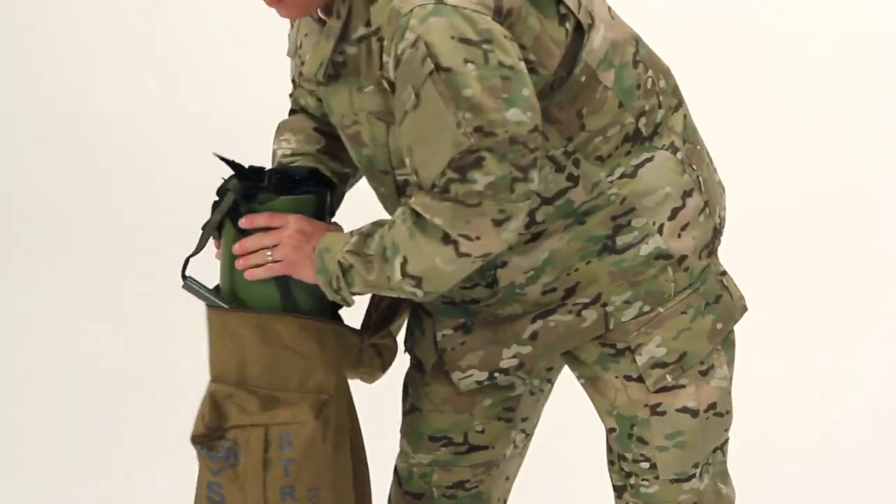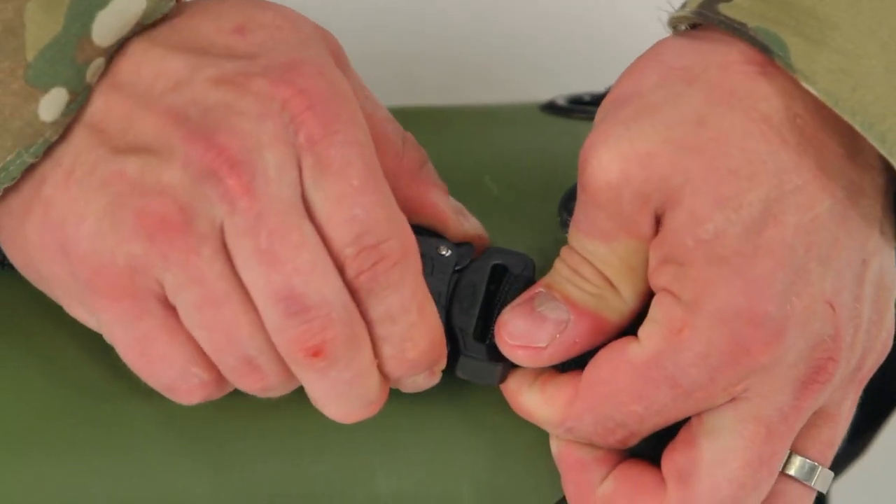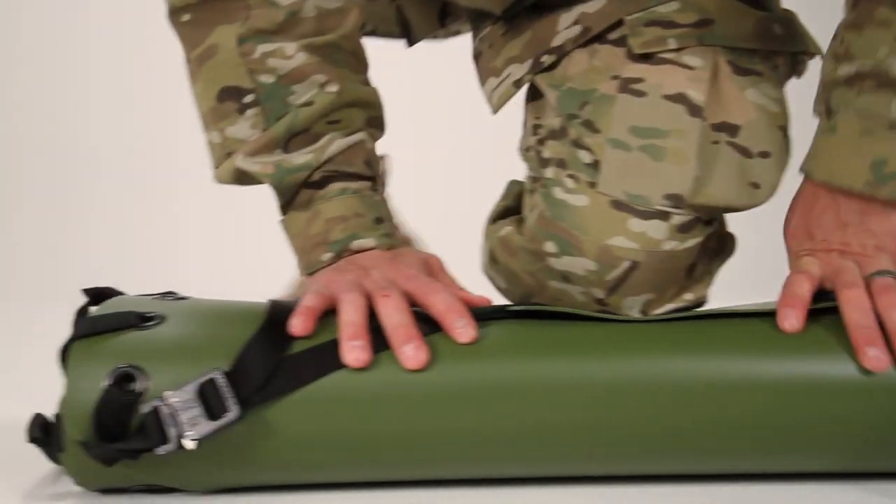Unzip the pack and pull out the Sked. To open it, release the tension on the cobra buckle, then use your thumb and forefinger to push the quick release.